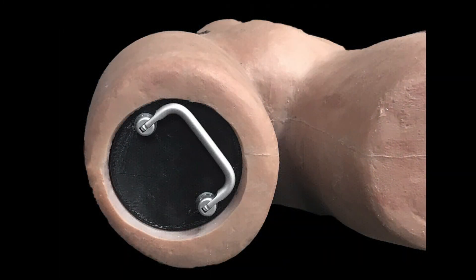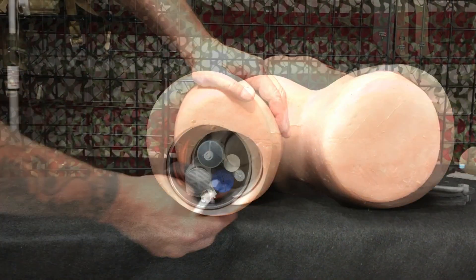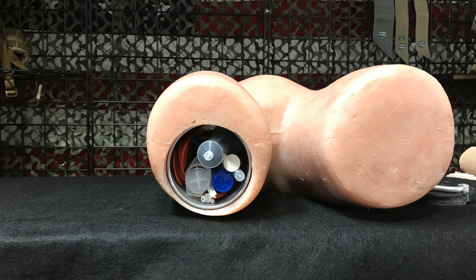The multi-task training mannequin also comes with a storage compartment on the thigh. To open, simply grasp the handle and pull back. You can use this compartment to store X-TAT training applicators, sponges, or other supplies.